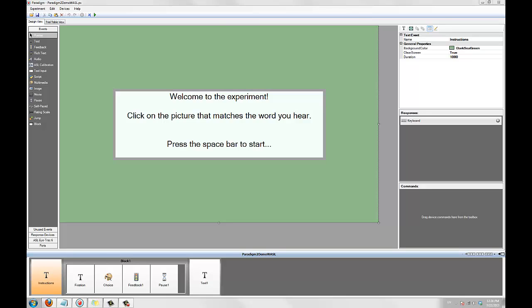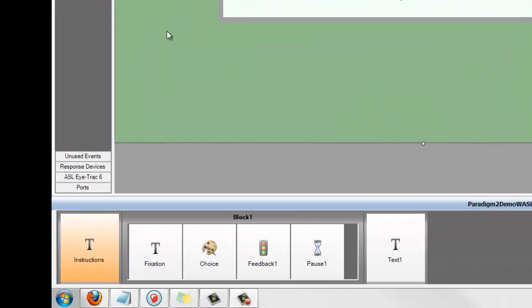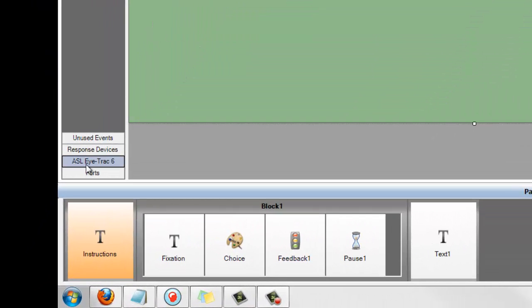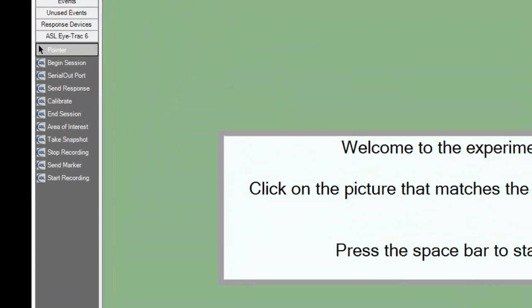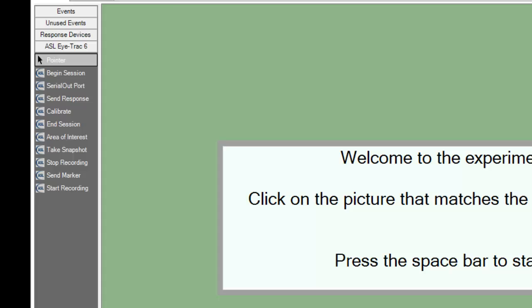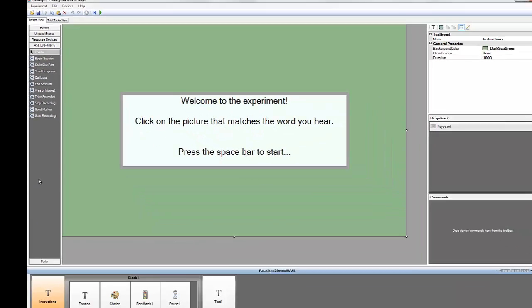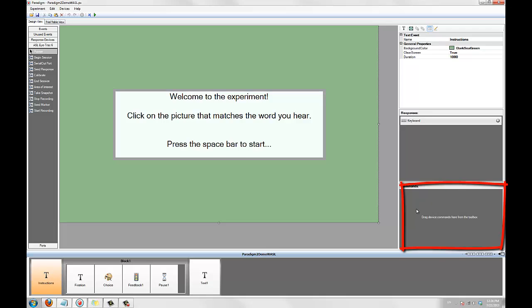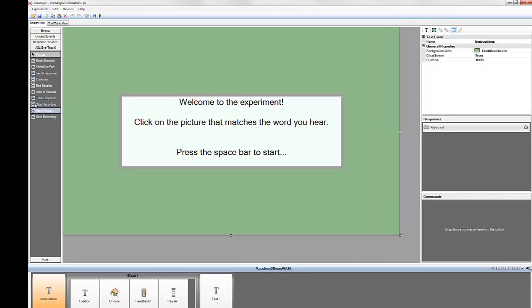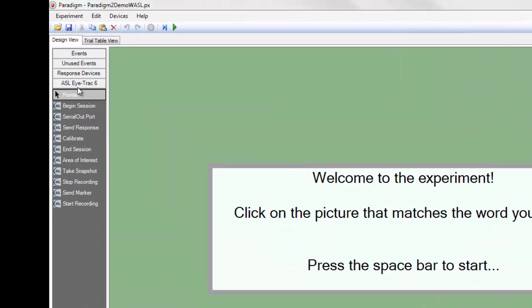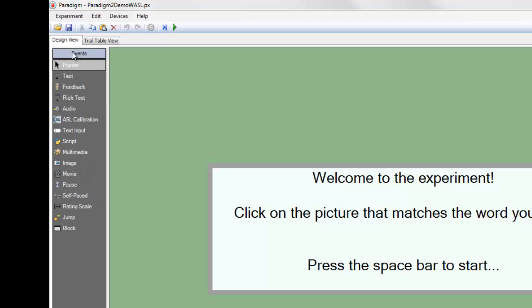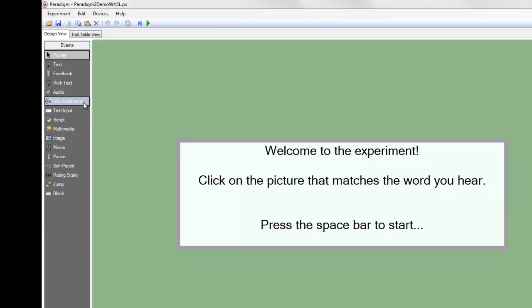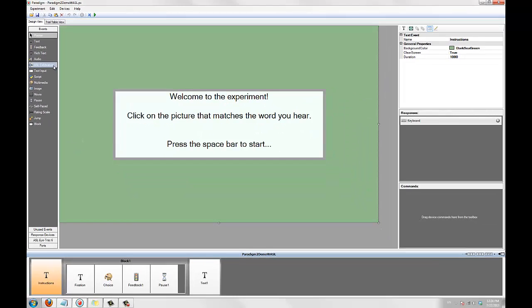After you've installed Paradigm Elements for ASL, you'll notice that a new iTrack6 toolbox has been added. This new toolbox contains all the ASL eye tracker commands you can add to your experiment. ASL elements are always added to the commands area of a Paradigm event. You should also notice that a new ASL calibration event has been added to the events toolbox.